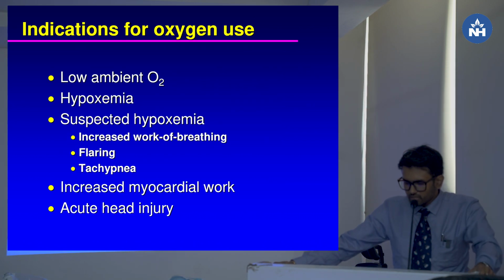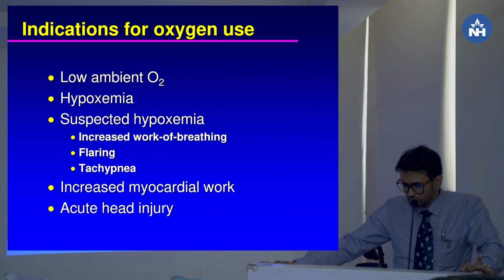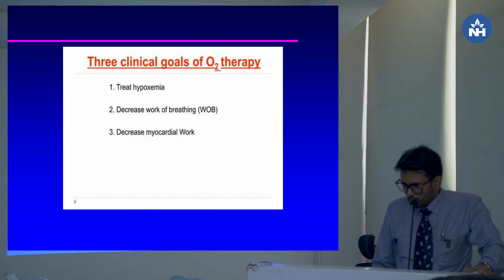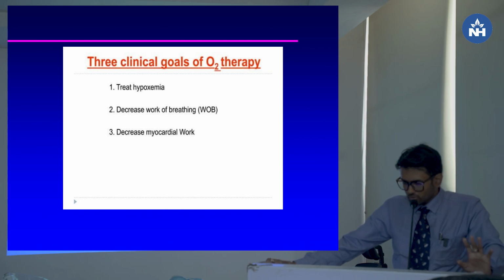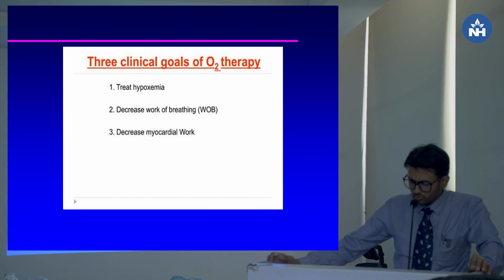The common indications are low ambient oxygen, hypoxemia, and suspected hypoxemia. The clinical symptoms are increased work of breathing, flaring, tachypnea, increased myocardial work and acute head injury. The common goals are to treat hypoxemia, to decrease work of breathing and to decrease myocardial work.